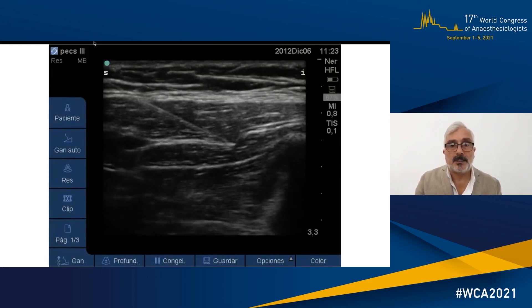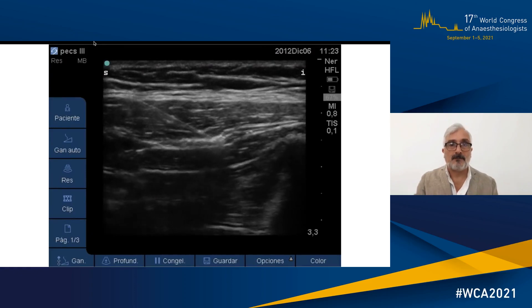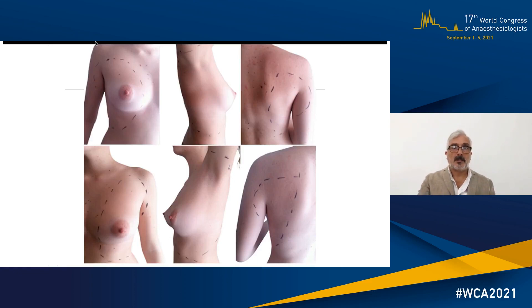You can see here that with one injection, it is very easy to hydrodissect the plane. Just focus on the tip of the needle and how it blows open that fascial plane in the middle. The result is a good spread of local anesthetic covering multiple lateral intercostal nerves, as you can see here. With this kind of sensory mapping and the ease of performing this block, there are beneficial indications that will be used in the future following the description of this block.